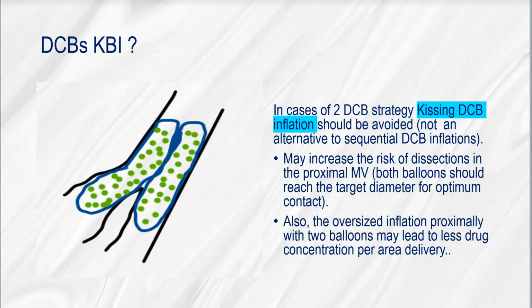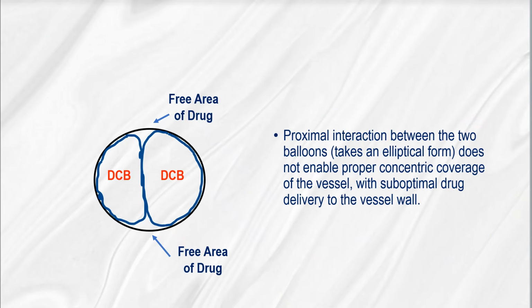Also, the oversized inflation proximally with two balloons may lead to less drug concentration per area delivery. In addition, the proximal interaction between the two balloons takes an elliptical form, which does not enable proper concentric coverage of the vessel, with suboptimal drug delivery to the vessel wall.